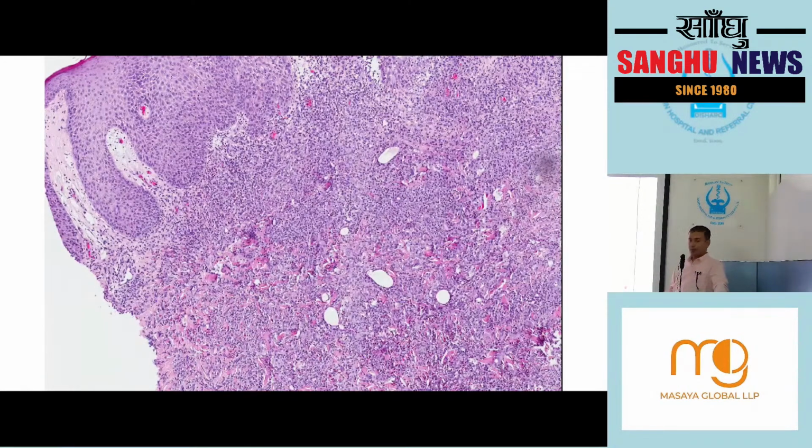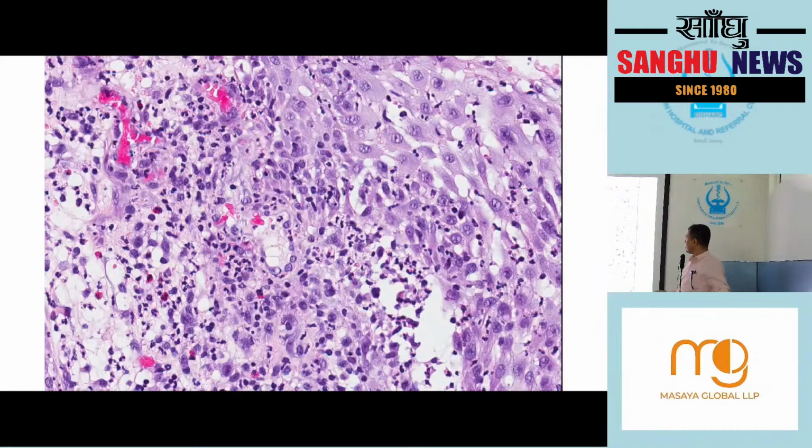This is a closer view. Some epidermis here, and some collagen I see in between. This is a closer view. I see some spongiosis here. Some eosinophils or neutrophils going up. Here also some eosinophils, neutrophils. Some cells look like large lymphoid cells, I would say, at this stage.